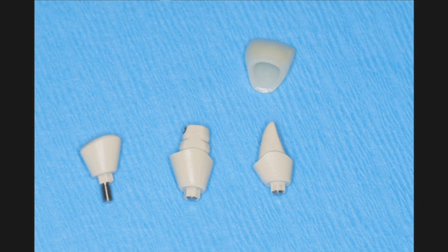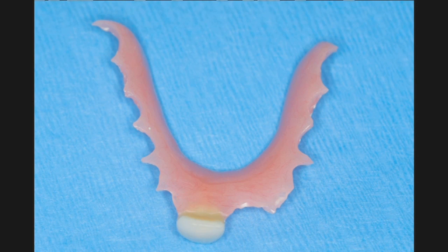Now, very important to realize that it's possible in a periodontally involved area, tooth extraction area, that we may not be able to torque that implant appropriately, and we would not necessarily immediately load the area. So a flipper type appliance was also fabricated, which again gives me a little safety device. If I didn't feel the implant was torqued, nor should it be immediately loaded, I could put the custom milled healing abutment in place and then use the flipper type appliance to replace the missing tooth.